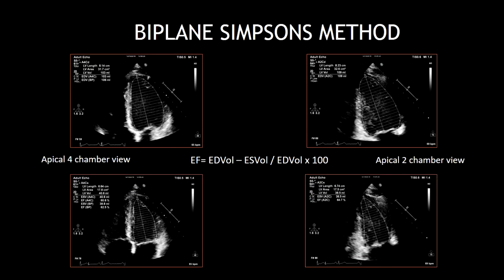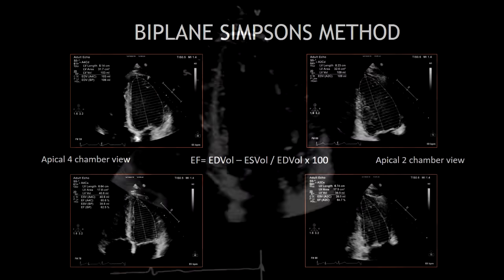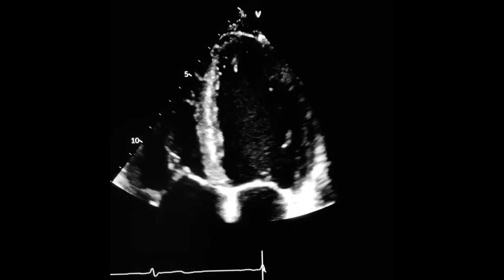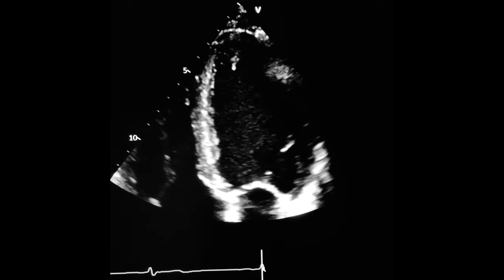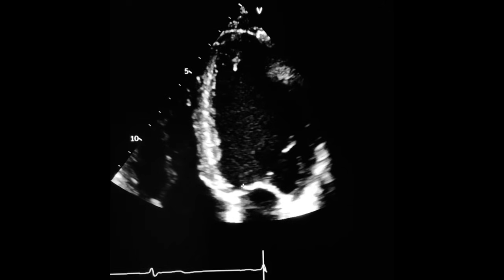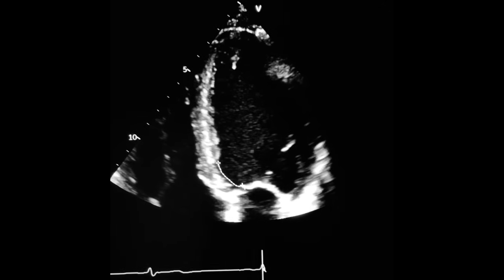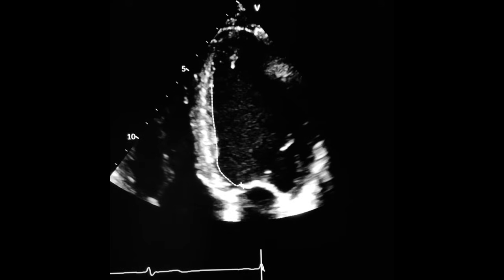Now, I'm going to show you step by step how to estimate the ejection fraction using the biplane Simpson's method. First, find your apical four-chamber view and obtain a zoom view of the left ventricle. Freeze the image at the end of diastole and trace around the endocardial border to get the end-diastolic volume.